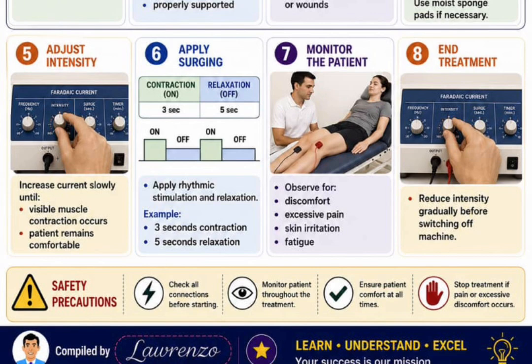You get it now? So you have to monitor the patient and stay there, because you don't leave. Another thing about this procedure is that things can go wrong. There could be skin burn, there could be overstimulation and fatigue, there could be a drop in blood pressure, or a spike in blood pressure, because when you are contracting the muscle, you are increasing venous return, and that could be bad.